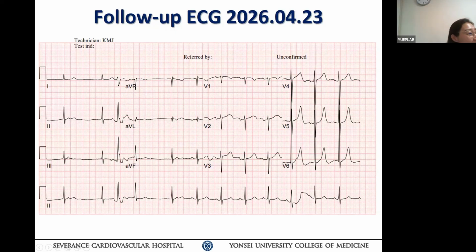So, do you want to interpret this ECG? Okay, let's start from Dr. Gang, because we have the international conference at 9 o'clock. So, please.